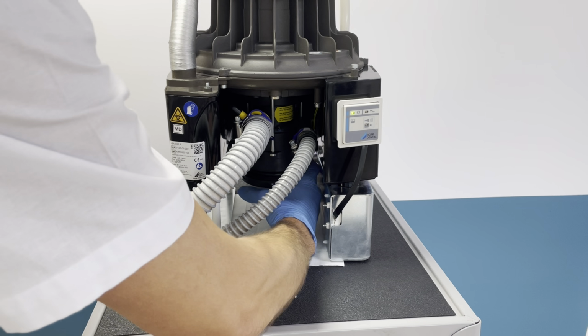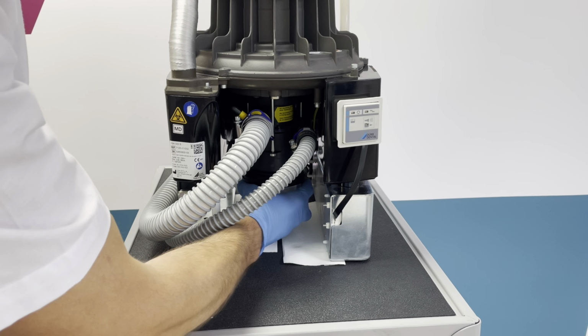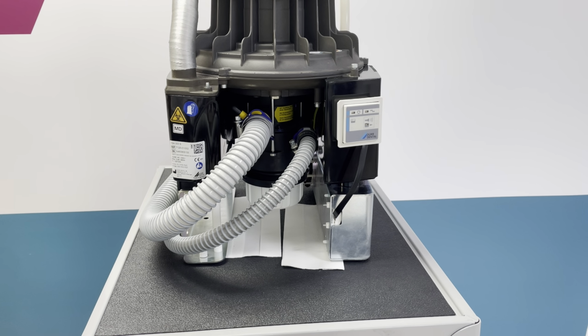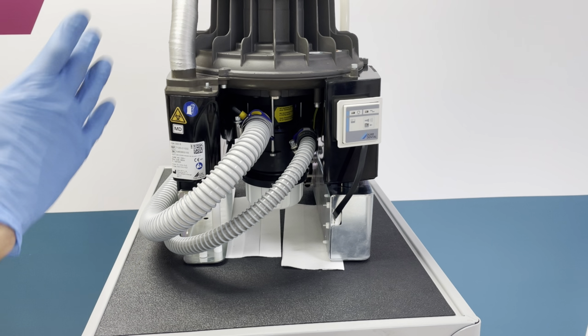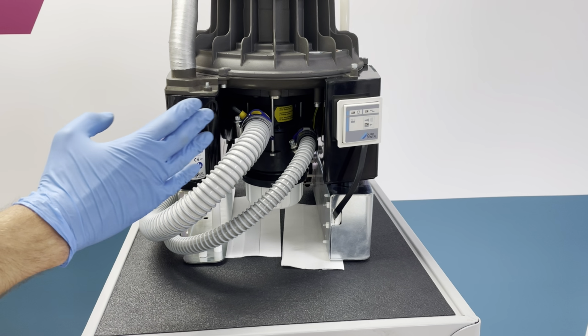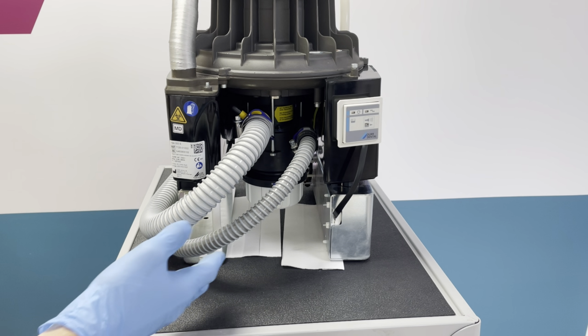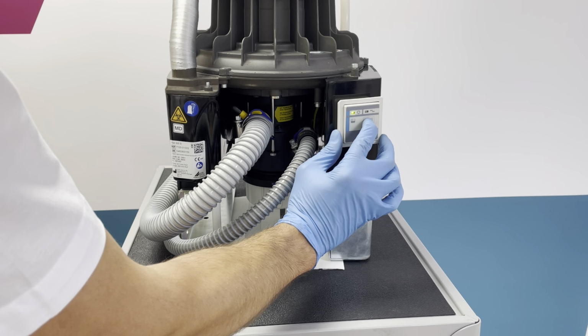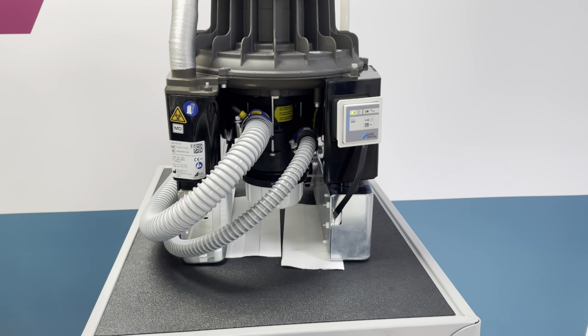If, for instance, you've misloaded the pot or there's a problem with the machine, it will flash red and the machine won't start. So if you, for instance, didn't isolate the machine, that's perfectly fine. The machine won't start when you're performing maintenance. You can just press and hold this button for about 3 seconds and then it should click over to green to say the machine's back up and running.